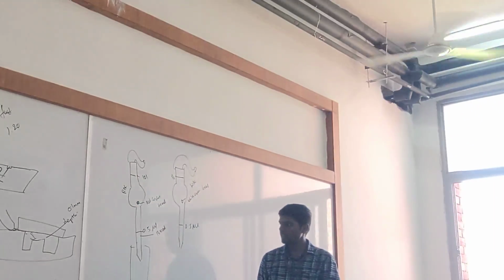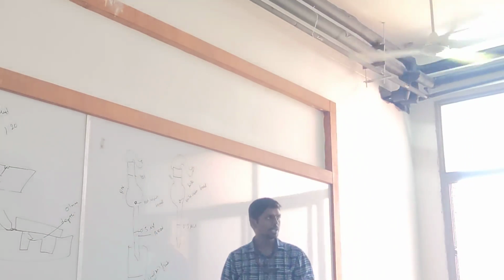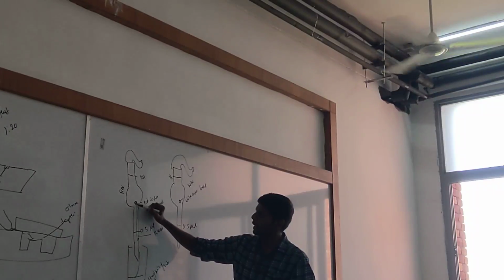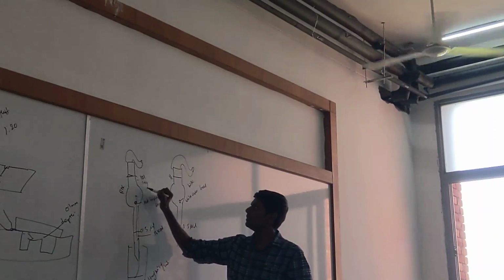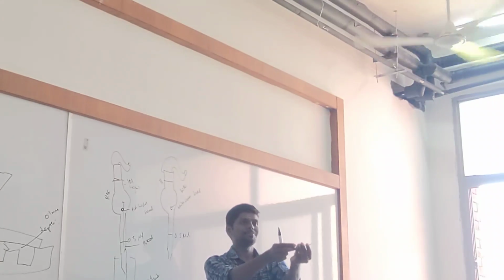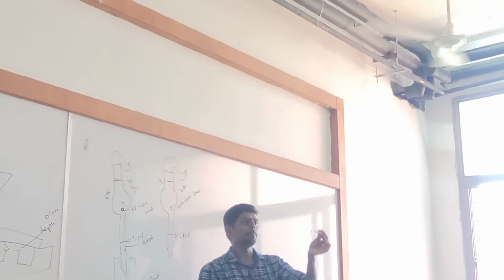After collecting the blood sample, now you will take the Hayem's fluid. Now you will start drawing Hayem's fluid. What happens? Hayem's fluid will take the blood and the blood will be mixed here. Up to the 101 mark you will take Hayem's fluid. Now in this bulb you will mix the blood for even distribution. You rotate it like this, so the blood will be mixed. That is the purpose of this bulb.